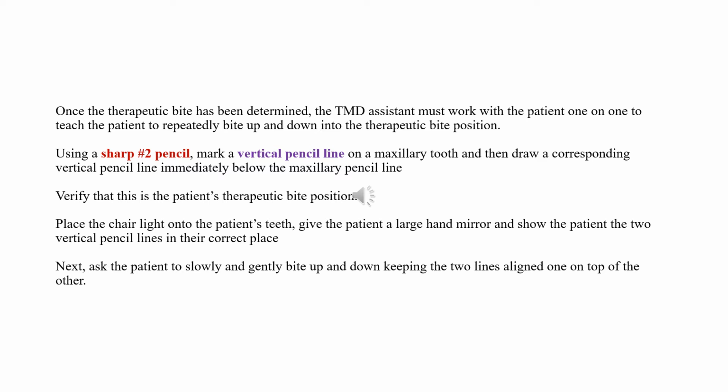It's a cheap one that should be clean. It has to be clean. And show the patient the 2 vertical pencil lines in place. Next, ask the patient to slowly and gently bite up and down, keeping the 2 pencil lines aligned, one on top of the other.